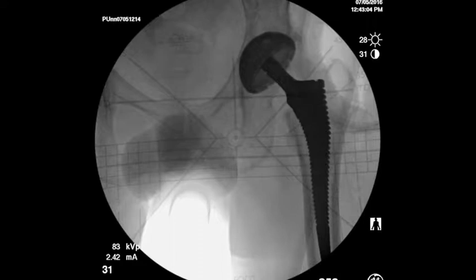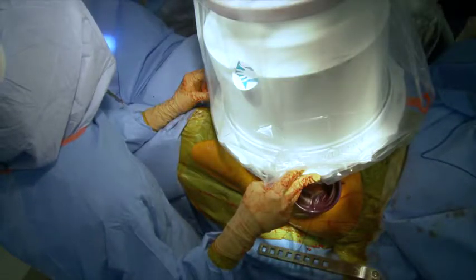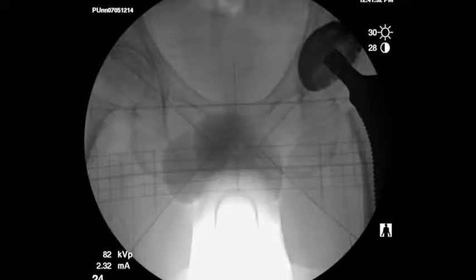I intentionally will broach to one size within where I think I'm going to be. So if I think I'm going to need a size 13 stem, I'll stop at about an 11 or a 12, even if it feels like I could go bigger. And I'll get that shot broach or trialing there to look at how big the stem looks in the canal to know for sure that I can go up a size and not be too tight. So that looks like a good neutral pelvis shot in terms of his sacrum, in terms of the symphysis, in terms of his two lines there.